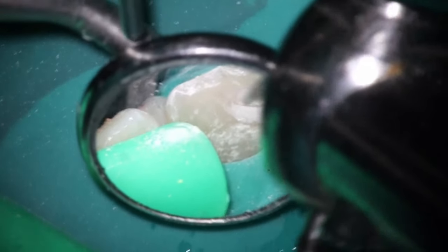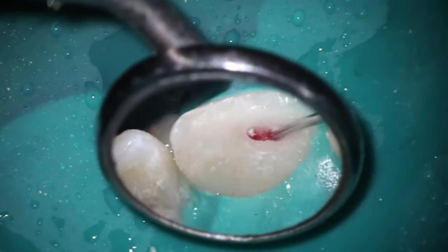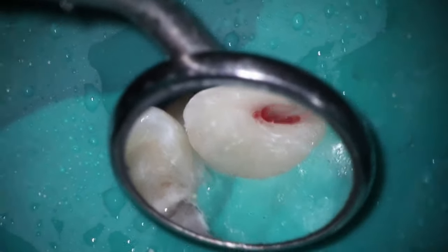Now we know that bacteria travel at about 3 millimeters a day. So I want to remove about 3 millimeters of the coronal pulp tissue. And that's what we're doing here. Just going to rinse that out, make sure there's no restorative material. And that's kind of what that nice healthy pulp looks like. And I'm just popping out that last little piece of IRM there.